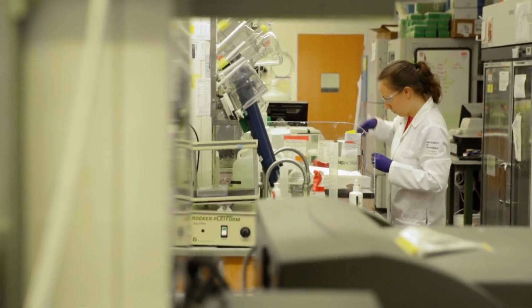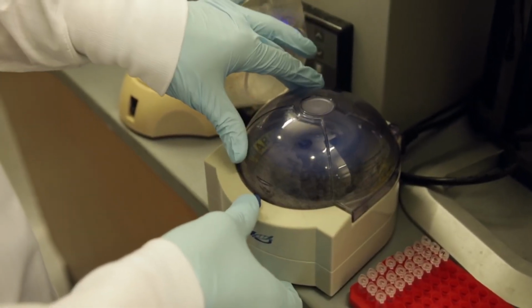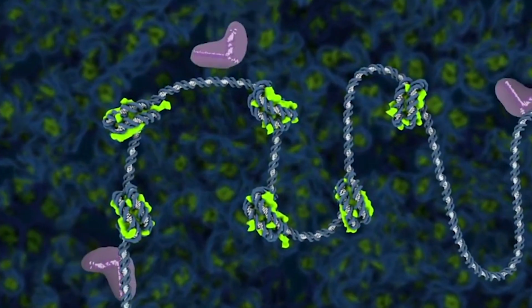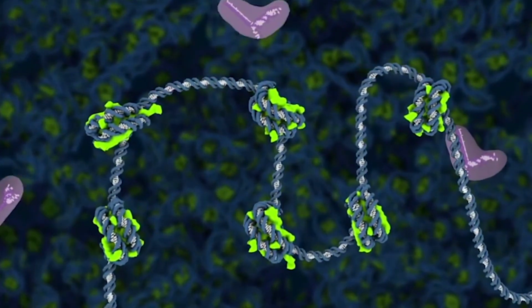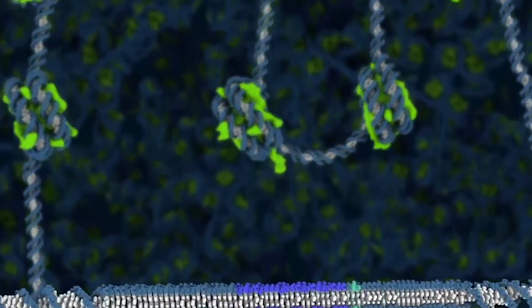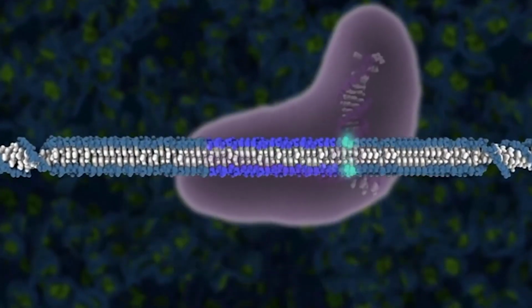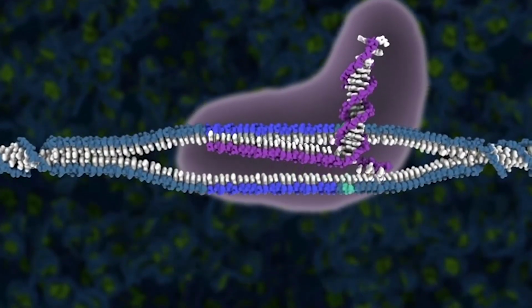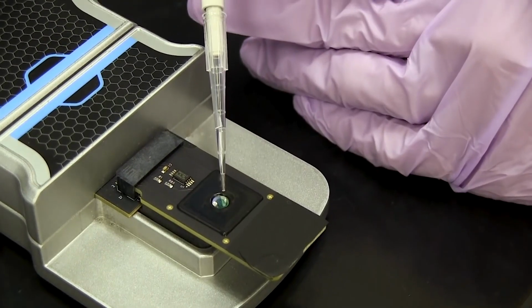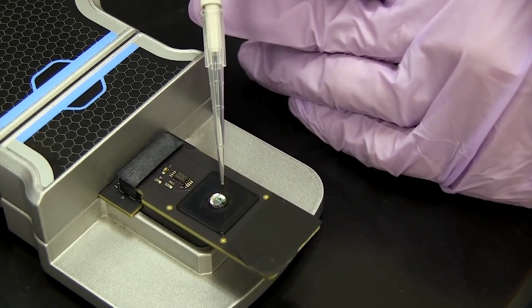For example, it can help scientists and researchers design better CRISPR complexes when they're trying to use these complexes for gene editing. Clinical trials are using CRISPR to edit and hopefully cure genetic disease. But researchers must first test whether the CRISPR molecule they design will find and edit the mutated gene and not a healthy gene nearby. With CRISPR-Chip, they could test this faster than ever before.